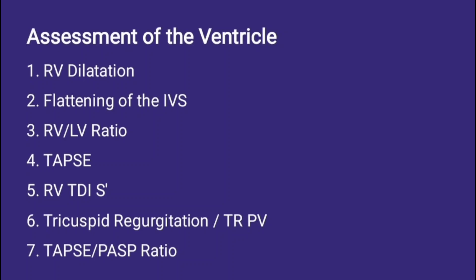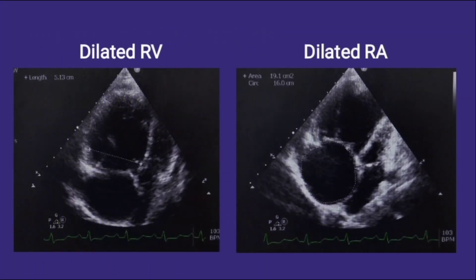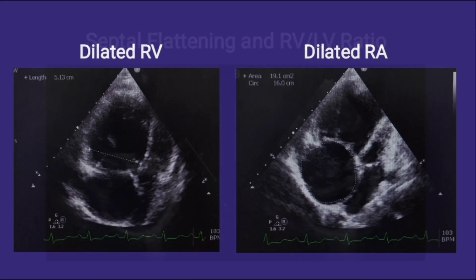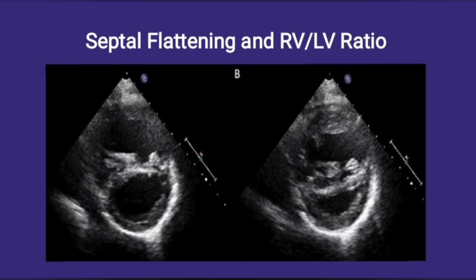The next step of assessment includes the ventricles. Parameters that confirm the presence of pulmonary hypertension include RV dilatation, septal flattening, RV/LV ratio, TAPSE, RV TDI S wave, tricuspid regurgitation, TAPSE/PASP ratio — most measured in the four chamber view. The first two images show a dilated RA and RV. A diameter of more than 42 mm suggests a dilated RV, and an area of more than 17 cm² suggests a dilated RA.